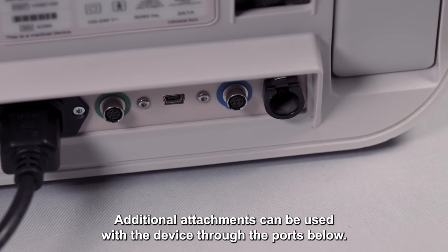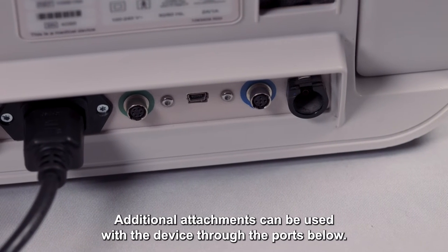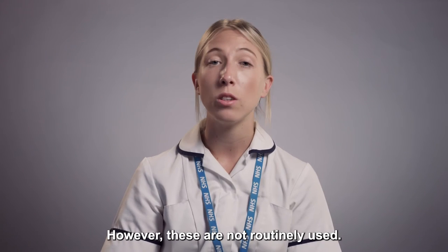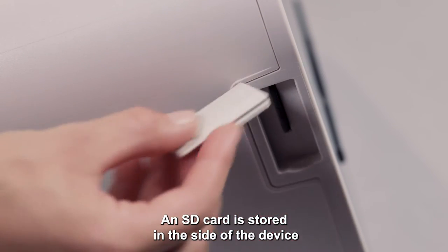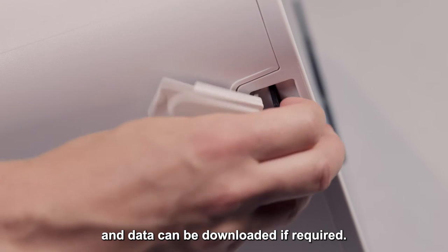Additional attachments can be used with the device through the ports below, however these are not routinely used. An SD card is stored in the side of the device and data can be downloaded if required.